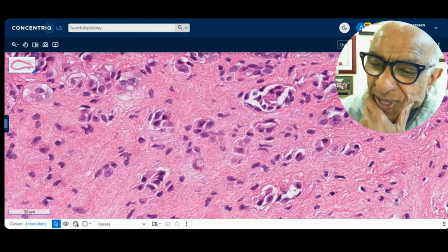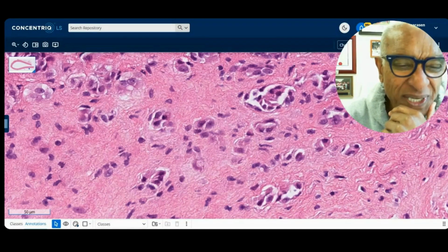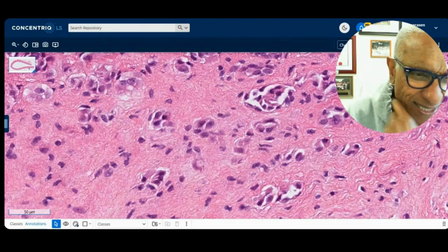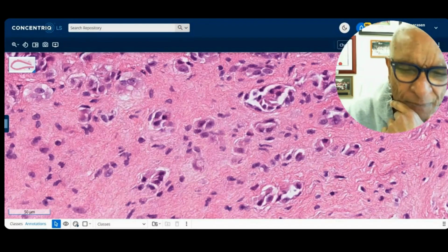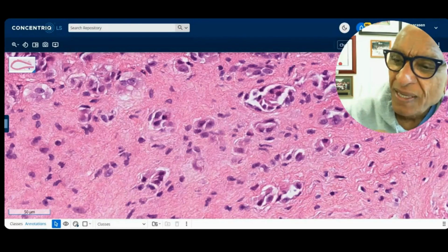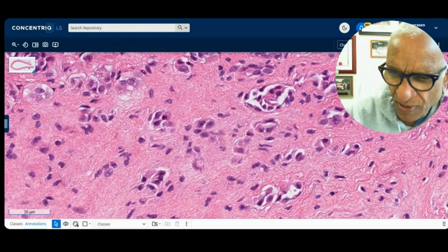Those are not mesothelial. Omar, calretinin, correct? Yeah, that was positive. But the idea is not to call it metastatic adenocarcinoma. These larger pink cells stain up with histiocytic markers. Okay, so take your pick. You may like CD68 or CD163. There's a new marker which you may or may not have, IBA1. I think it is IBA1 or IB1A. It's a very useful marker. Our hematopathology team has it, and I use it because it has a very clean background, which is very useful in distinguishing the background cells. So you can take your pick on which of those you have.